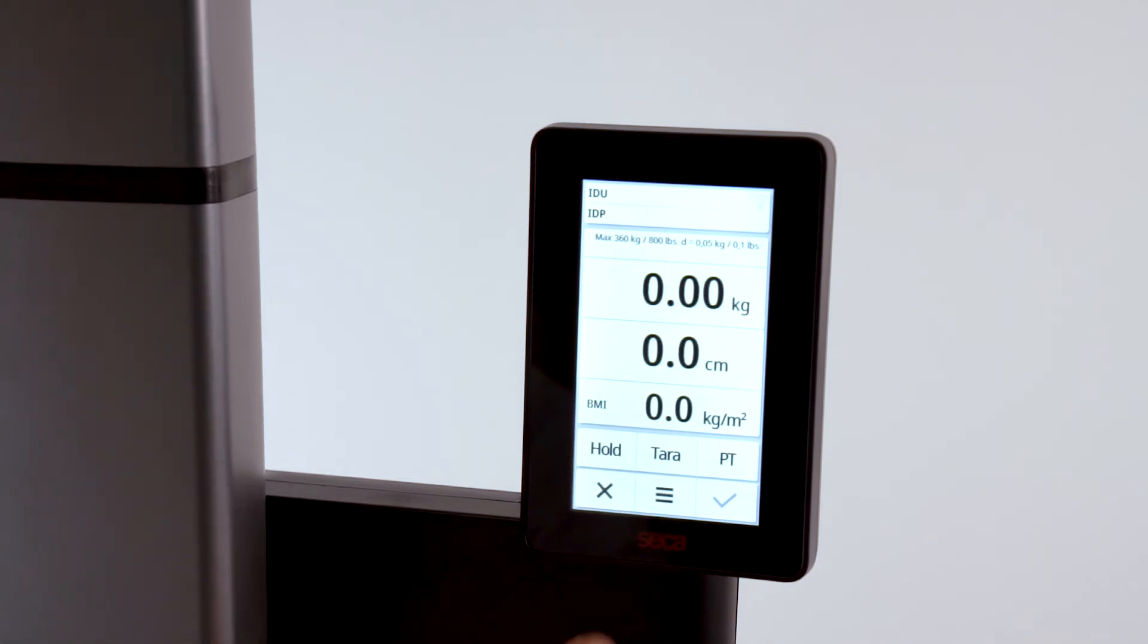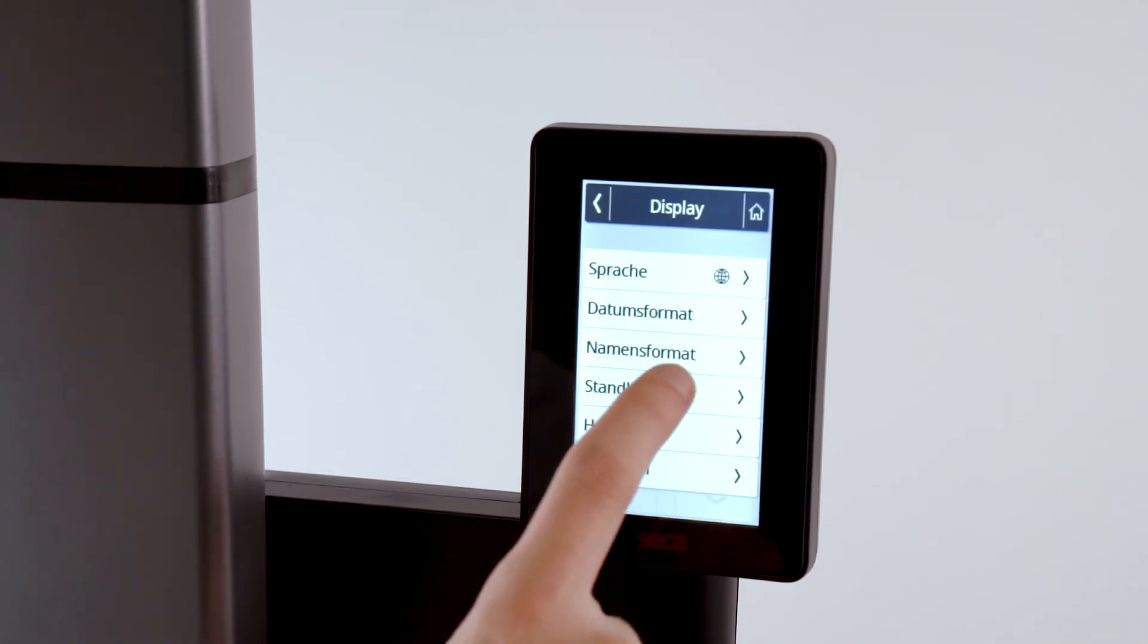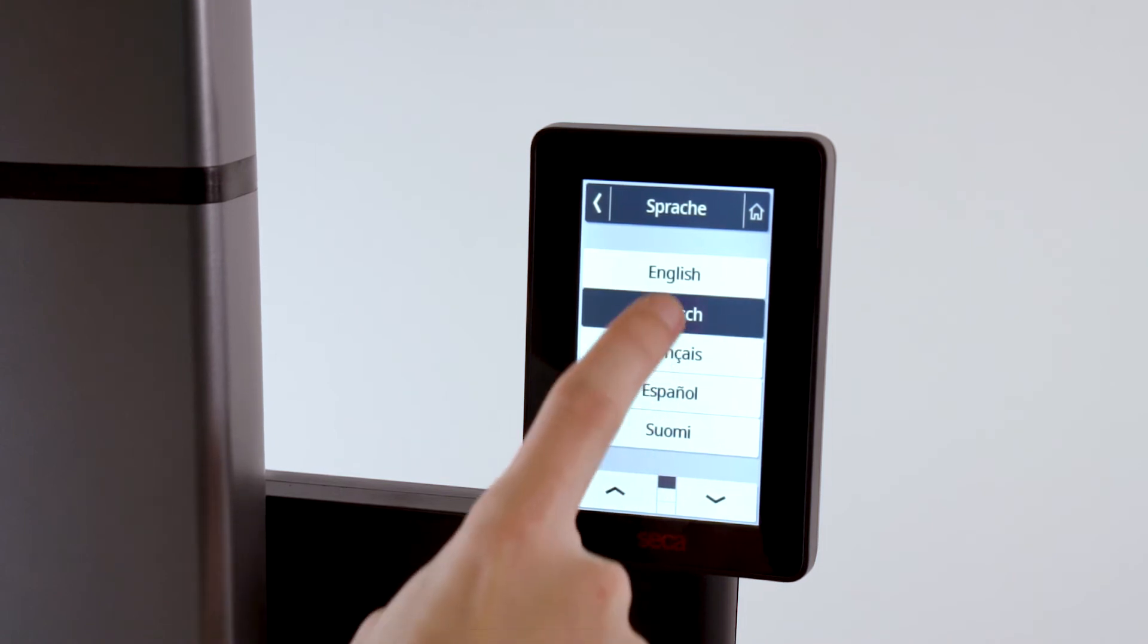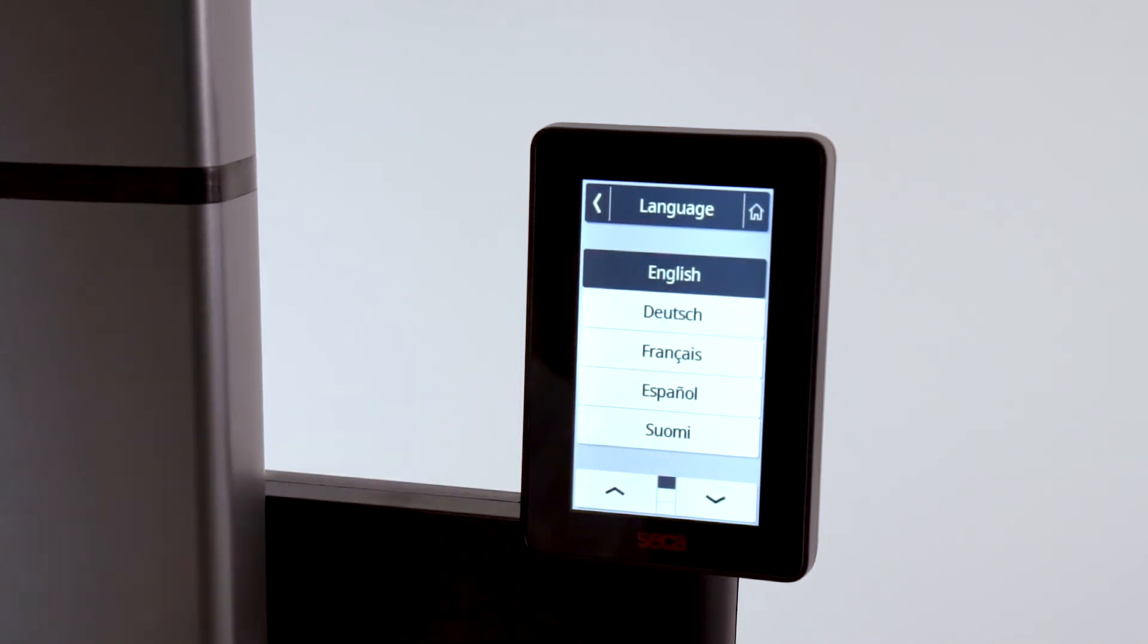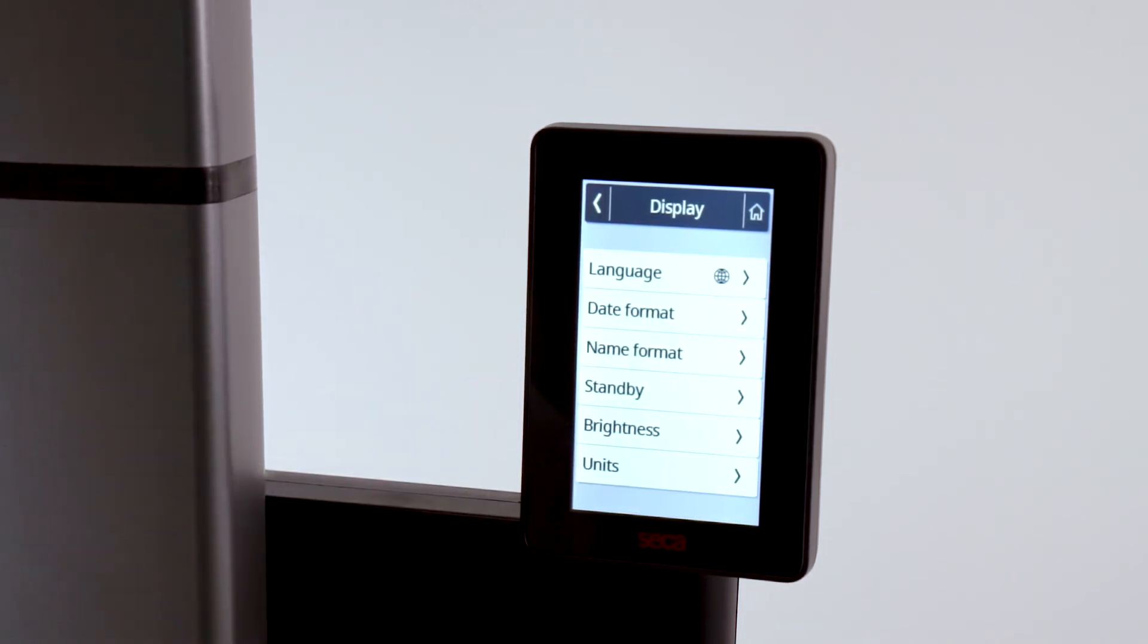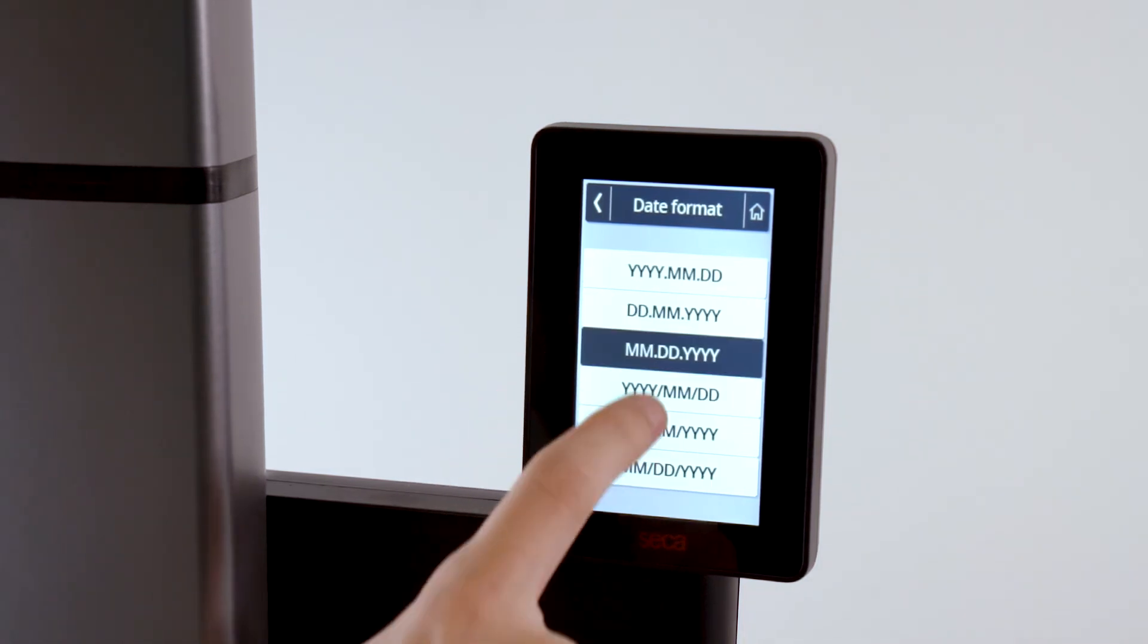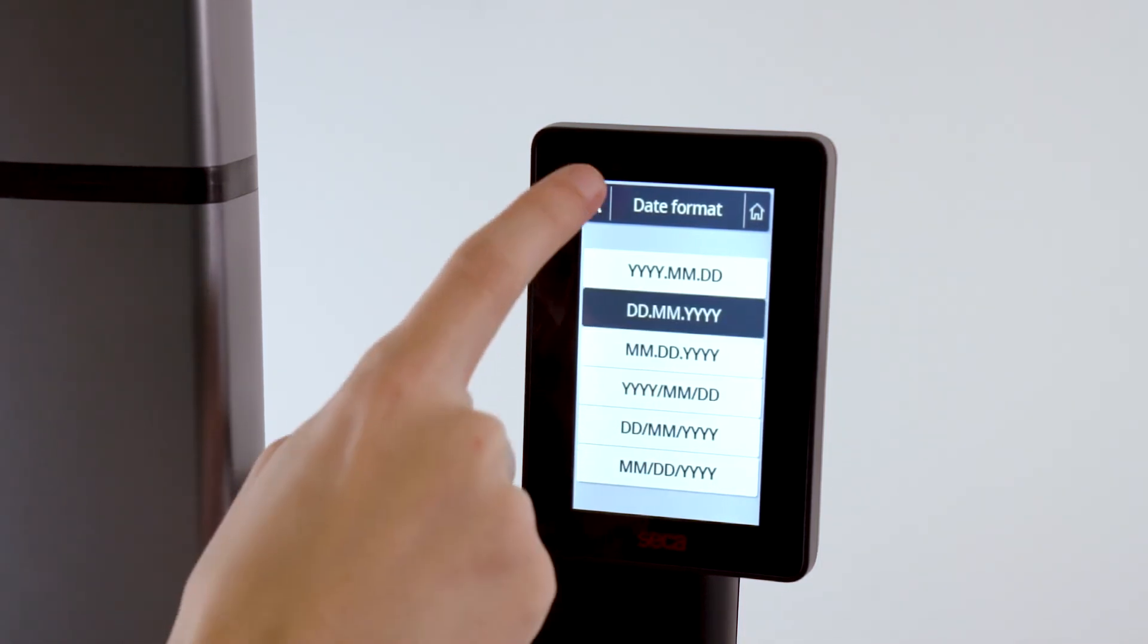To customize the display from the factory default settings, we recommend the following settings. Of course, you can always change these to fit your needs. Let's start with the display settings. Adjust the date format to the desired setting.